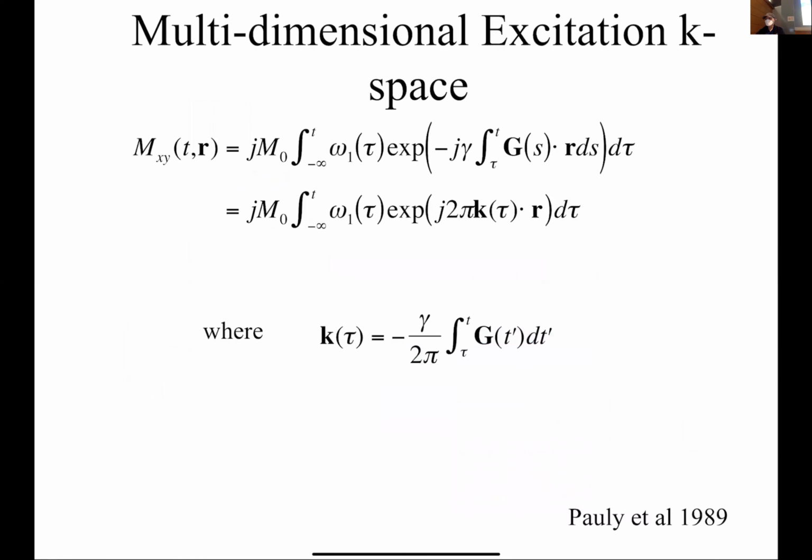Now I'm just going to talk through the next few slides just to give you a sense of what you can do with these pulses. So right now we've only talked about a very simple pulse exciting a rect function, right? And we said, well, to do that I needed a sinc function. And those are just Fourier transform pairs.